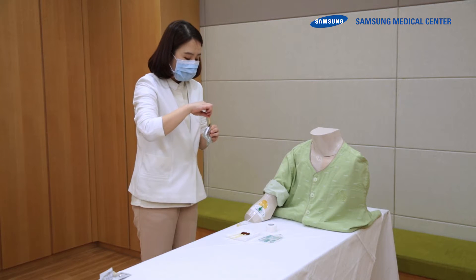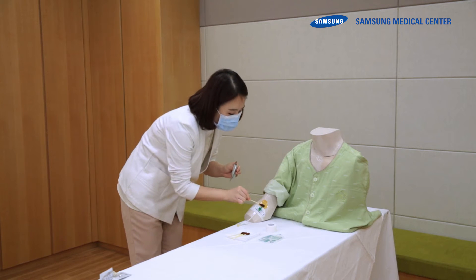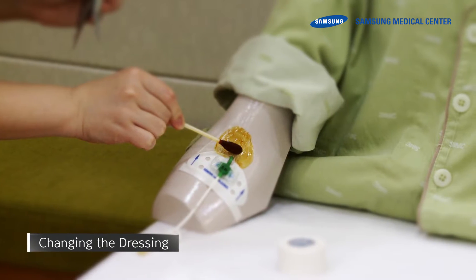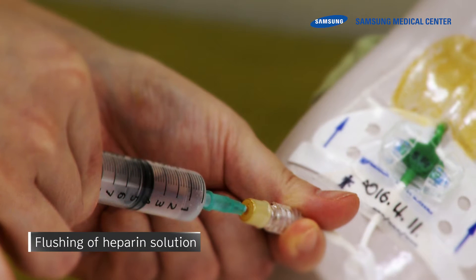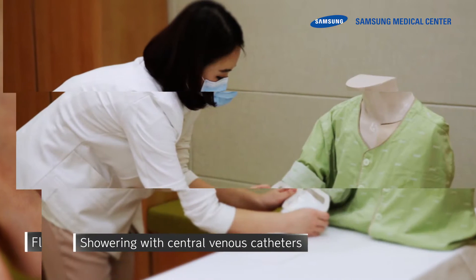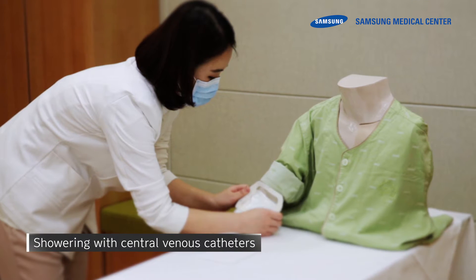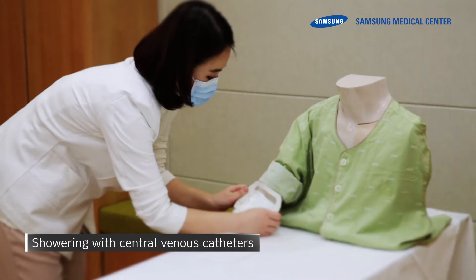This video shows how to disinfect the insertion site of the catheter in order to safely use the peripherally inserted central catheter, how to infuse heparin solution, and how to care for the peripherally inserted central catheter while taking a shower.